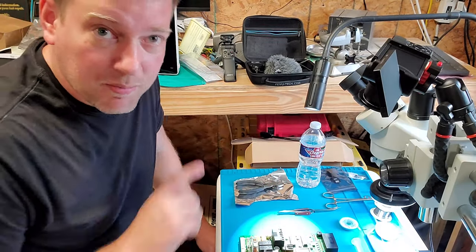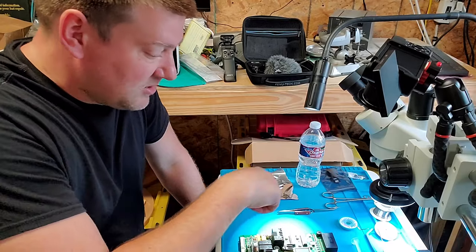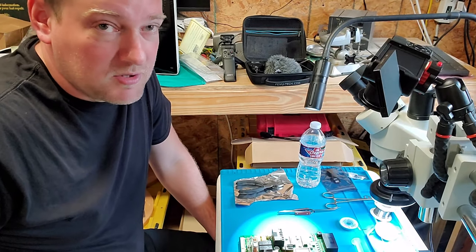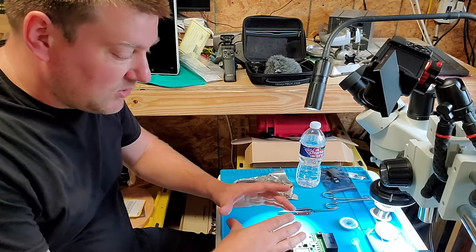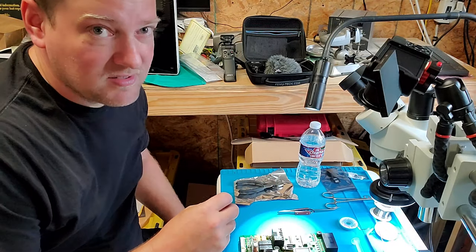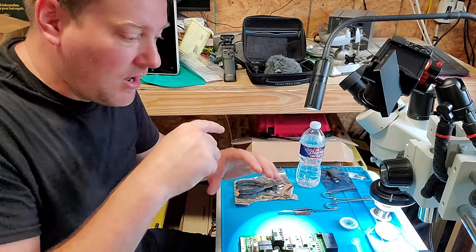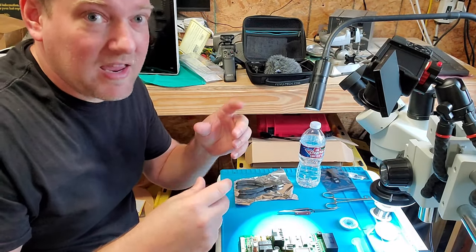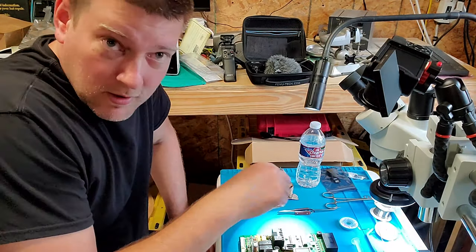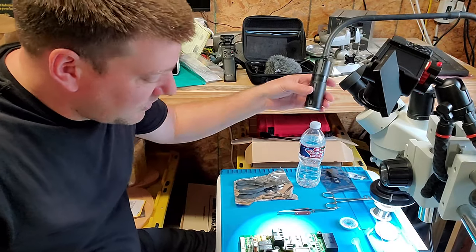I'm going to start out by preheating the board. I set my hot air supply to 200 degrees and, in a circular motion, start preheating the general area. We want to get that board up to about 100 degrees, which is far below the temperature of melting solder. What you want is to decentralize the expansion due to heating up a component. When you heat a component to 300-400 degrees in one spot, that one spot expands while all the surrounding areas are still cold, so it could cause cracking and complications further down the road. To minimize that, we do regional heating of the PCB, which is preheating your board. So that's one of the first things I'm going to do.